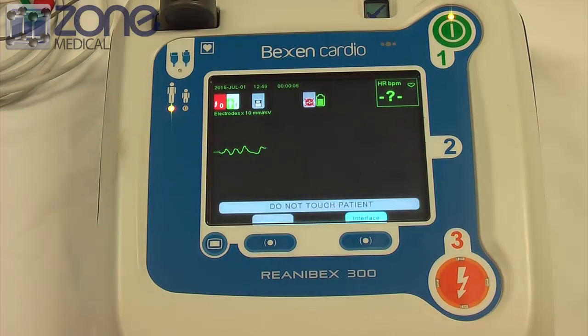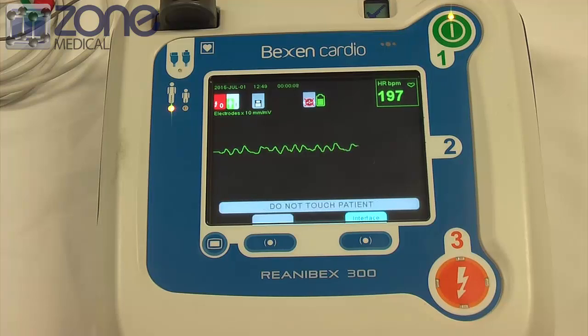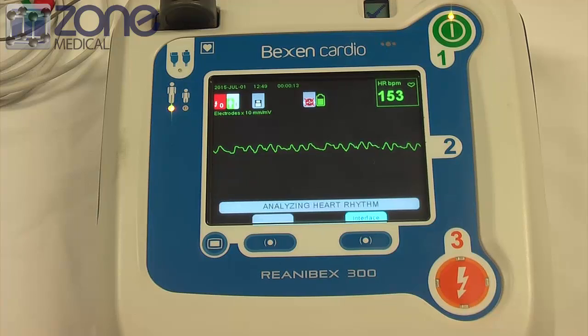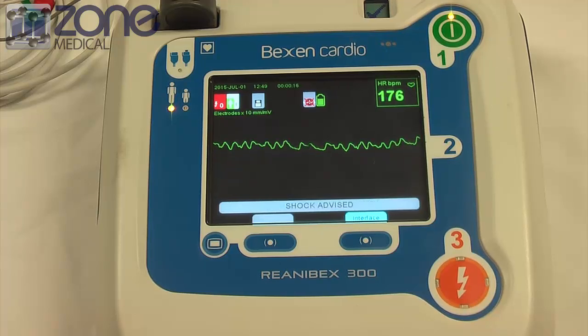Do not touch patient. Analyzing heart rhythm. Shock advised.